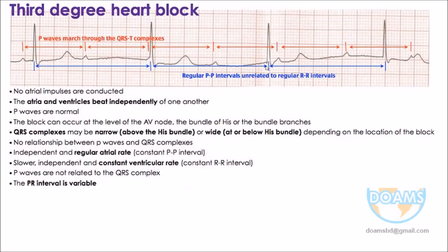And this P again, and another P again. Here also another P. So the P is hidden within the QRS. Am I focusing wrongly or rightly? Sorry, doctor, not the blue color, the red color.